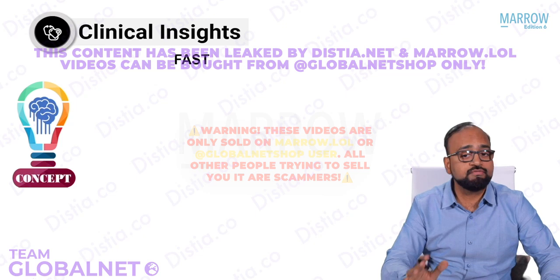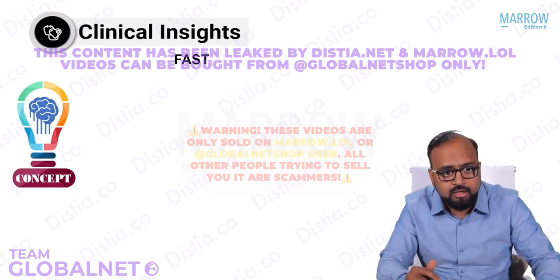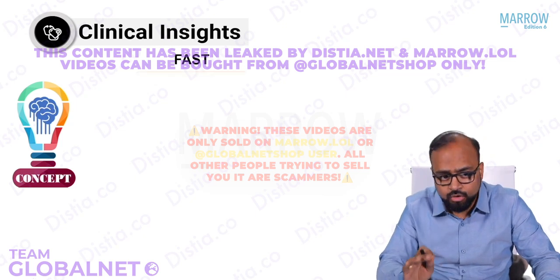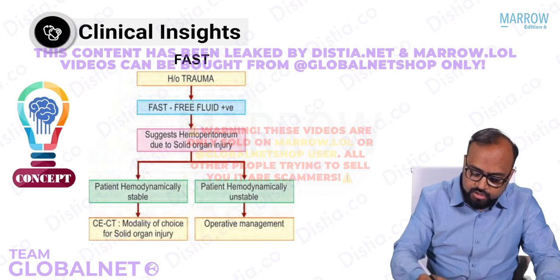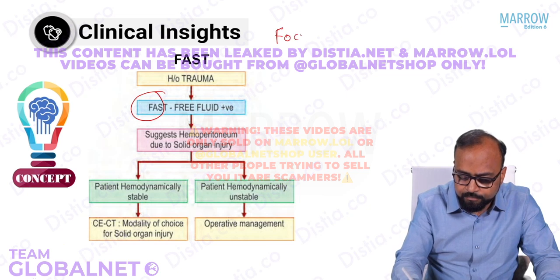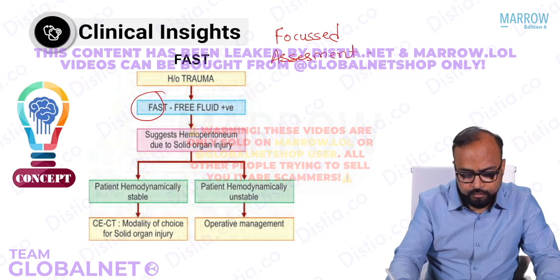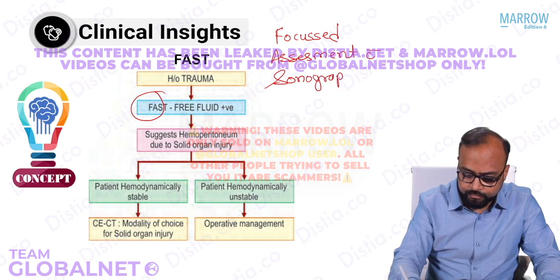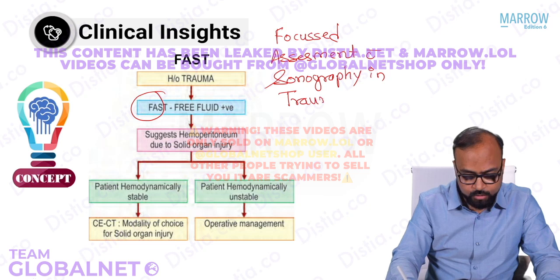Now we come to what is FAST. How do we clinically evaluate a patient of abdominal trauma? Whenever a patient comes with a history of abdominal trauma, the first investigation which is done for assessment of these patients is usually FAST. What is FAST? FAST stands for Focused Assessment with Sonography in a case of trauma, that is abdominal trauma.